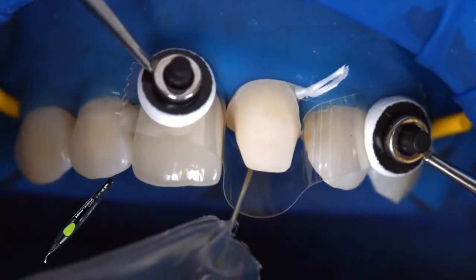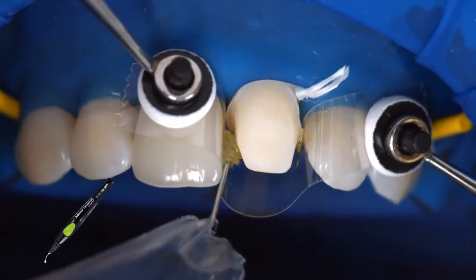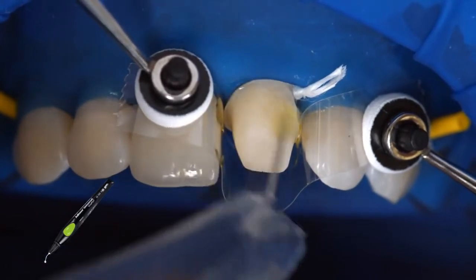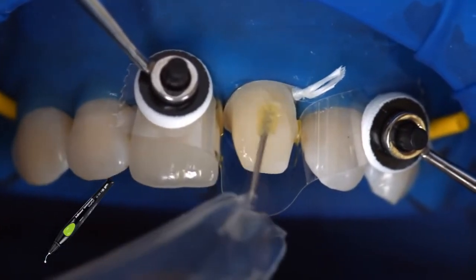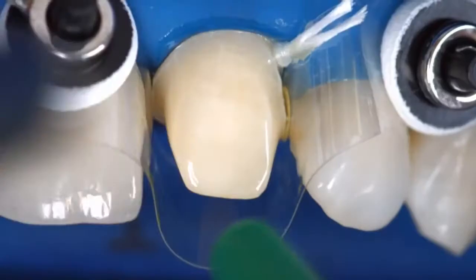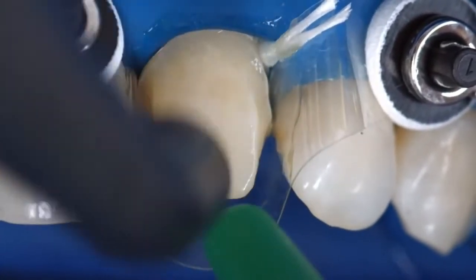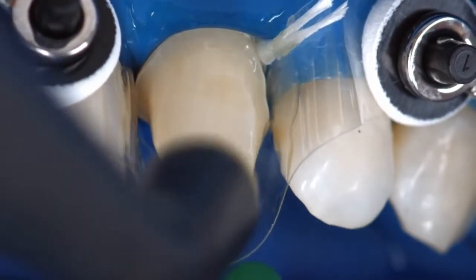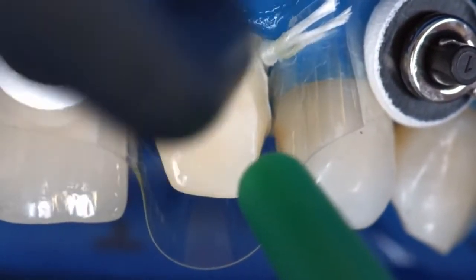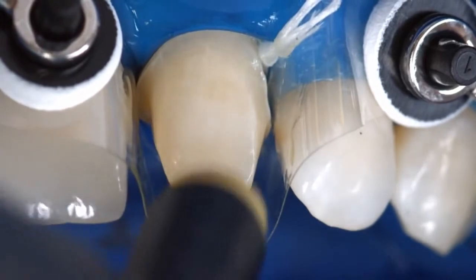Coat the entire bonding surface with Adhese Universal and scrub the adhesive in for 20 seconds. Disperse excess amounts of Adhese Universal with a stream of air until the mobile liquid film has disappeared. Make sure to avoid pooling.